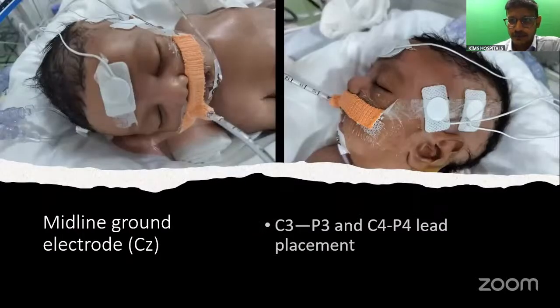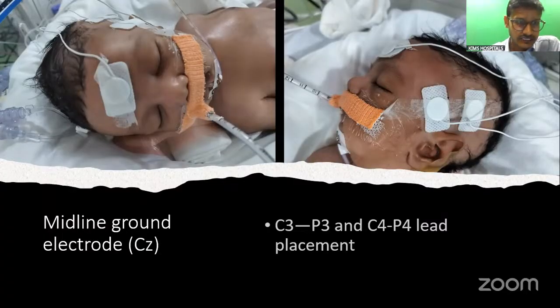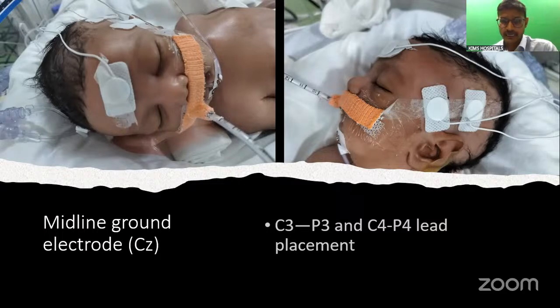Here we have a neonate. On the left-hand side, you can see the central part of the forehead where we have placed the ground electrode, which eliminates the artifacts. On the right side, you can see the C3, P3 placement. This is on the left side, and on the right side it will be just above, in front of, and behind the ear, so the central and parietal area.